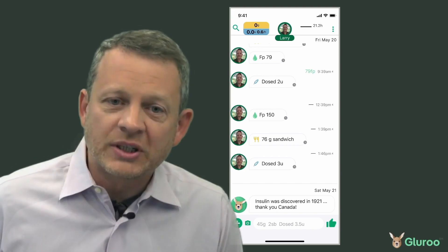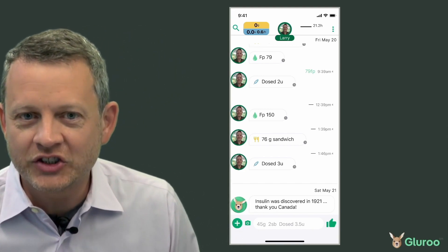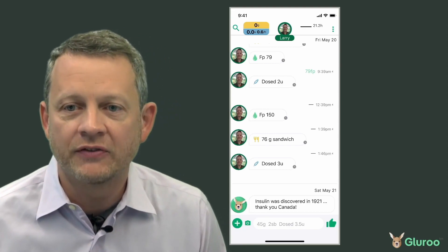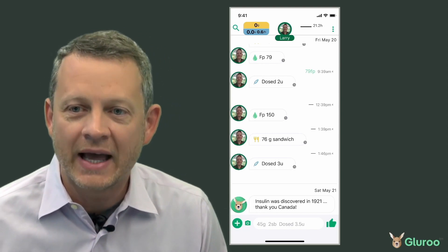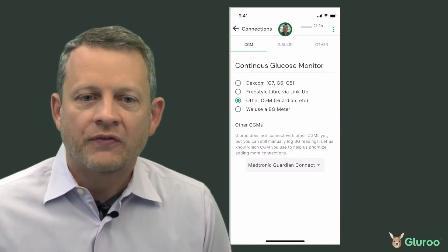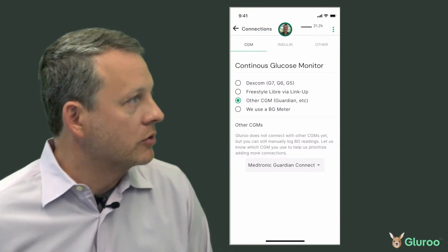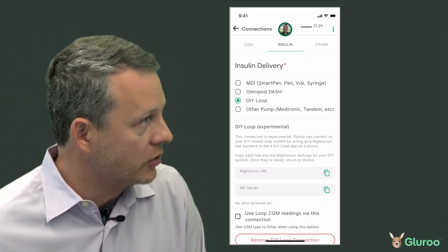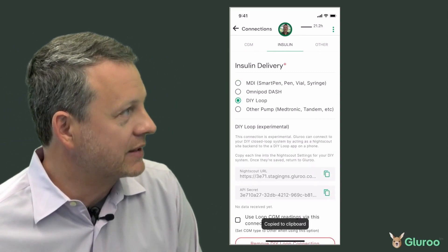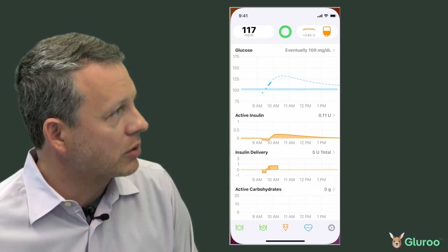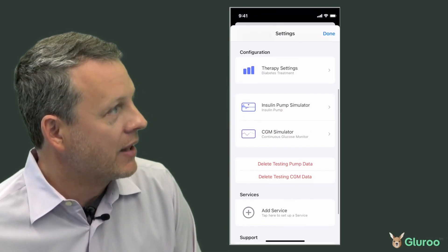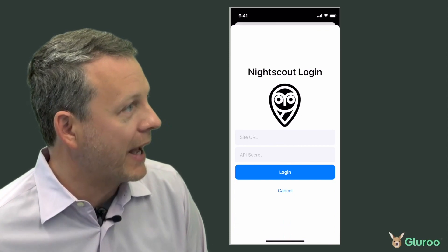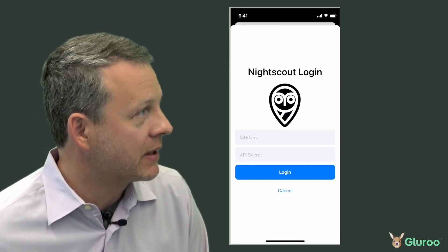LOOP supports this integration in an interesting way — it creates a NightScout-compatible interface that you can enter into LOOP. First, we tell LOOP our insulin delivery type is DIY LOOP, and that instantly generates a NightScout URL and API secret that we copy and paste over into the LOOP app's NightScout backend service.